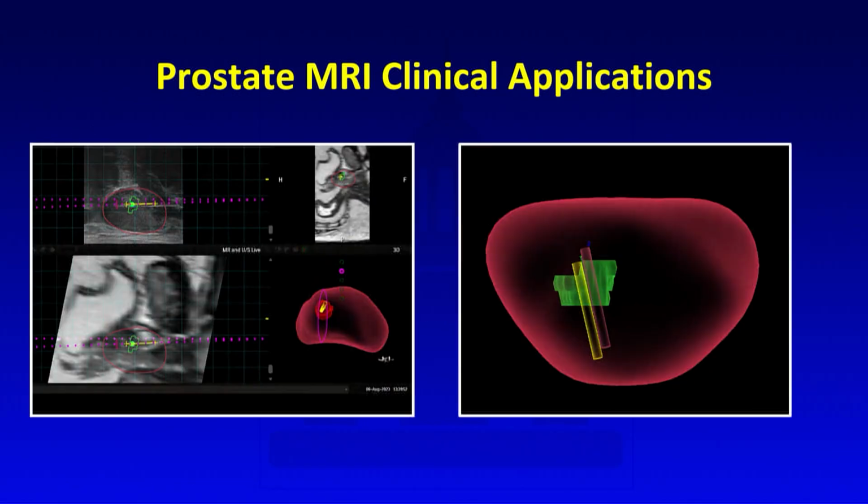I would say for us, one of the big volume builders is really this MRI-guided fusion biopsy. So before this fusion biopsy, we would do a handful of prostate MRIs a week. And these days, we're doing a lot of them. Prostate MRI is easily about 10% of our body MRI volume, and it continues to grow.